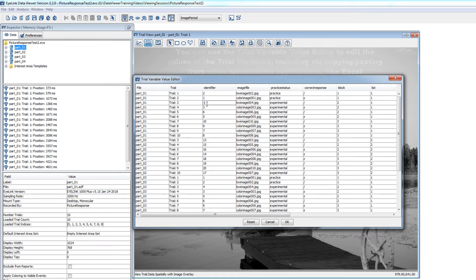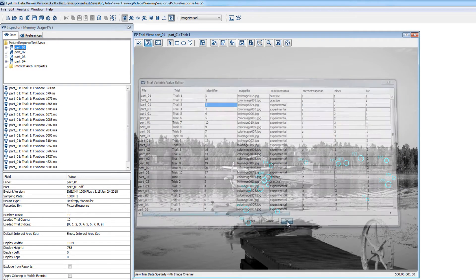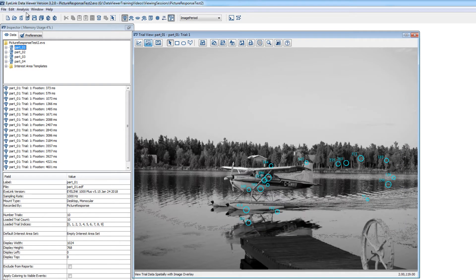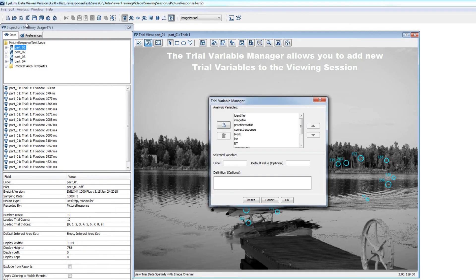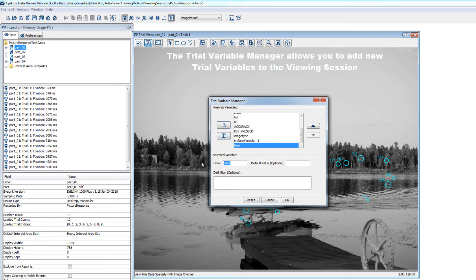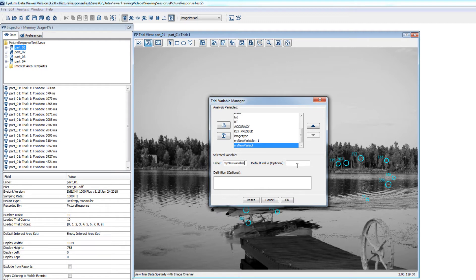If you need to add a new trial variable, you can use the Trial Variable Manager, which also can be accessed from the Analysis menu. You can click the New Variable button, and then give your new variable a meaningful label. If you like, you can also give the variable a default value for the trials of the viewing session.